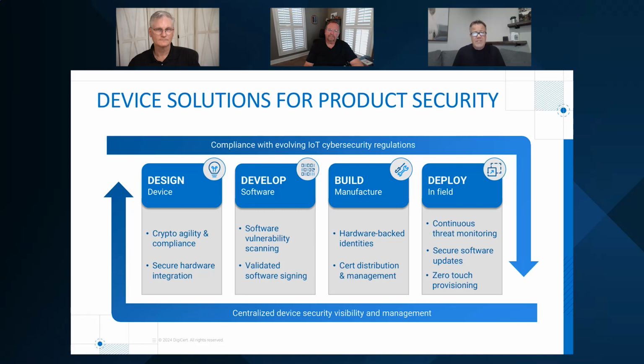And then if it's all scanned and good, are we signing it so that we only have validated software running on that device? So when the device is manufactured, is only legit software being installed, so that a third party manufacturer isn't adding something else after the fact?